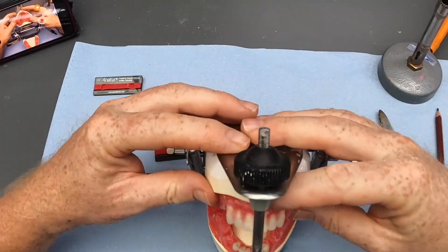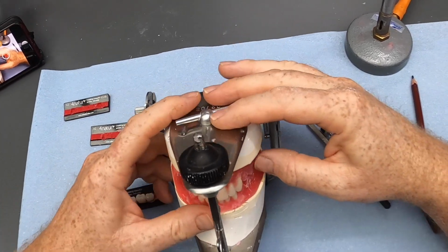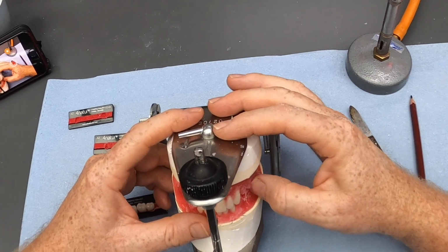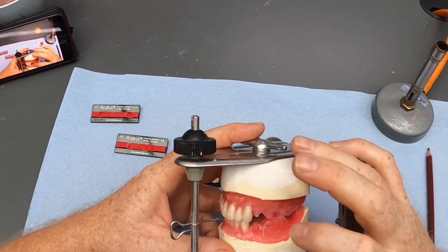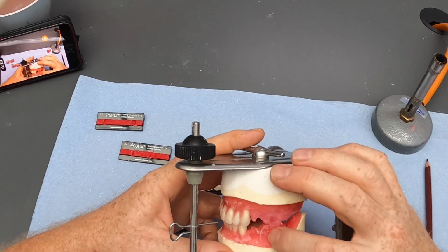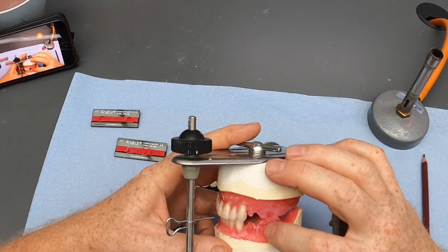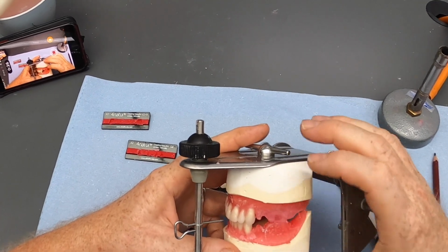Okay, so we've got the anterior teeth set. We might make a few tweaks to those as we go. Now we want to think about where we're going to be positioning the posterior teeth. The lower six is probably the most significant tooth with regards stability and so on, so we're going to look at positioning that in the ideal position to start with.